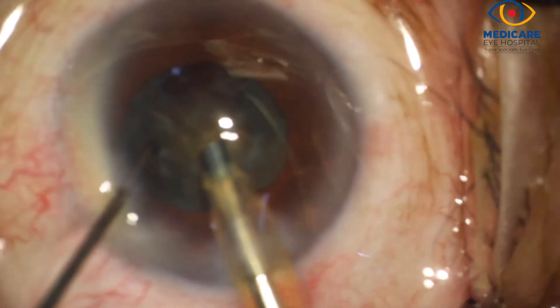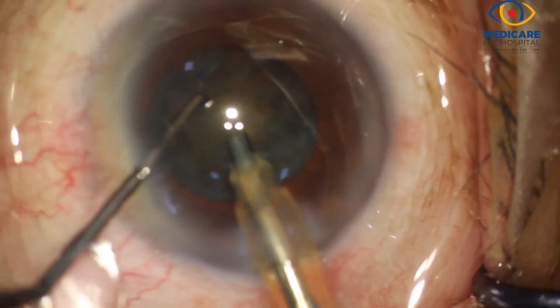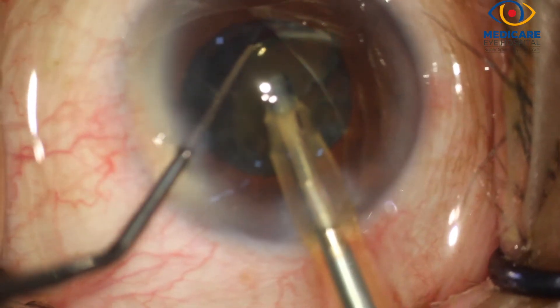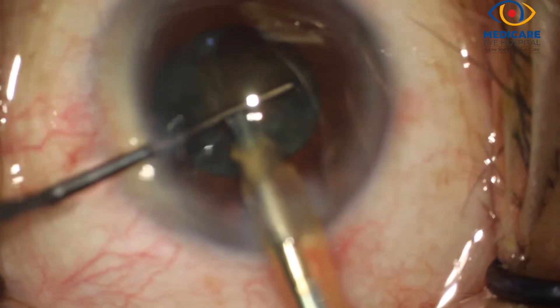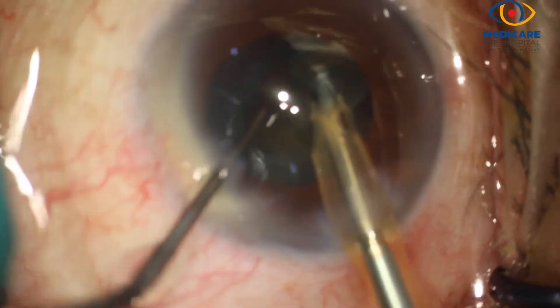Since the cataract is soft, care should be taken not to use excessive phaco power. The preferred technique here is that of small nuclear fragmentation and emulsification. This is easier to perform and prevents any inadvertent contact with the posterior capsule.